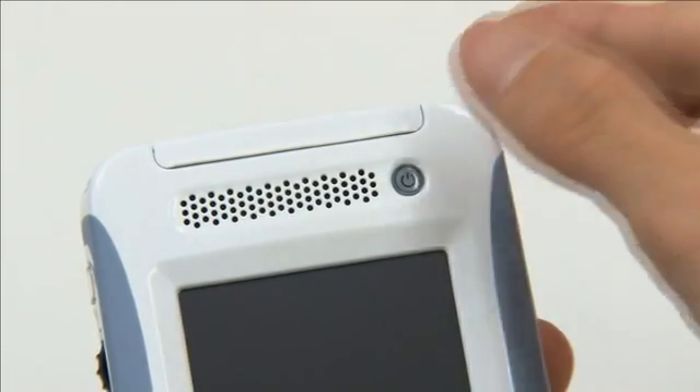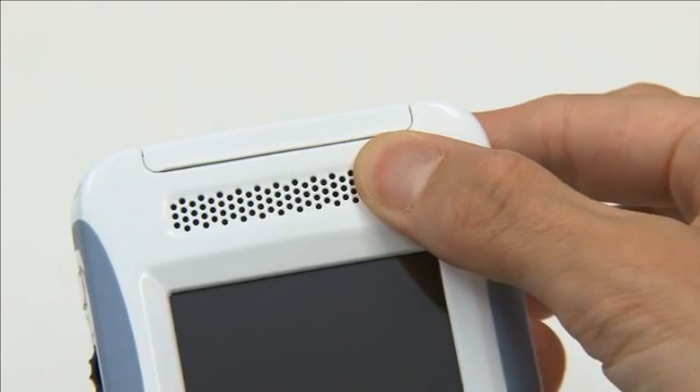This silver dot appears on the screen to indicate the orientation of the probe. To turn the power of the display unit on and off, press and hold the power button.